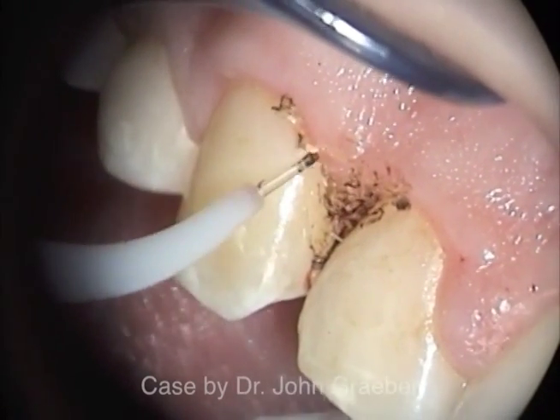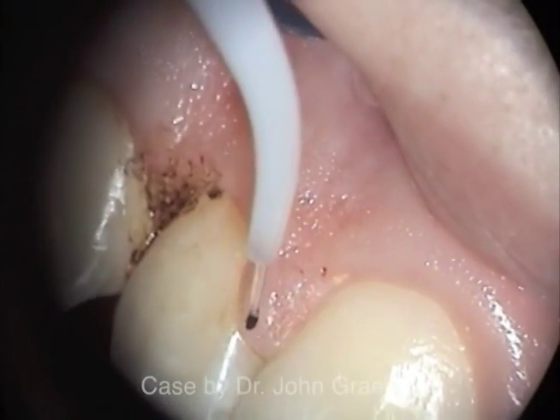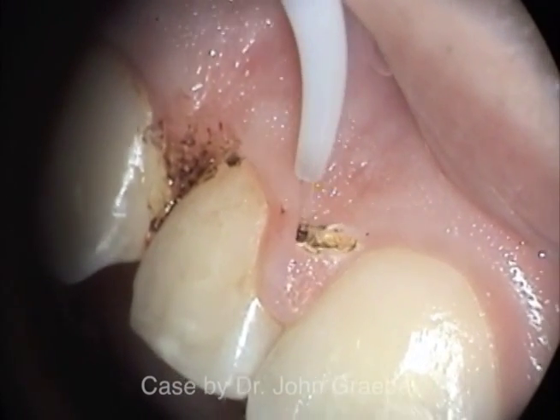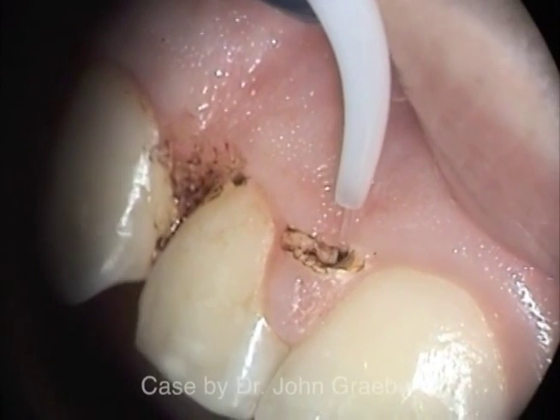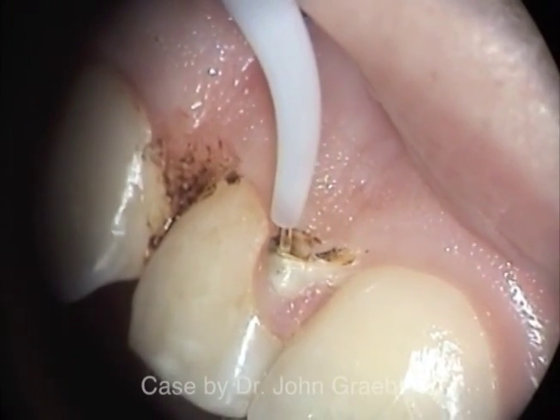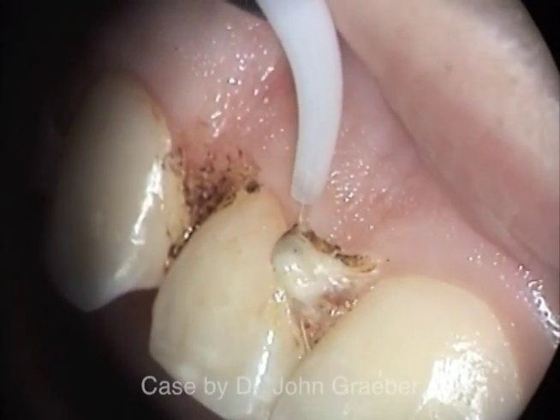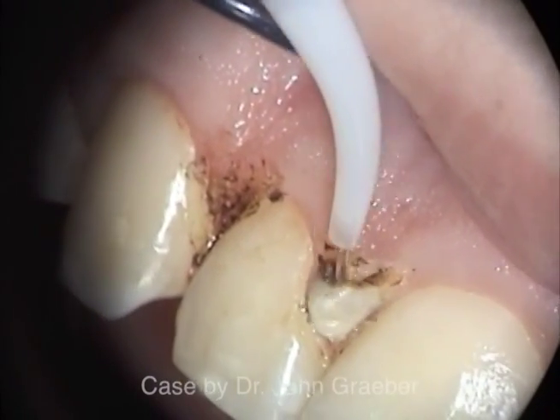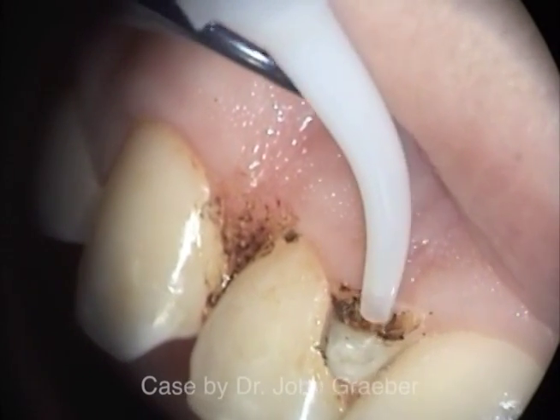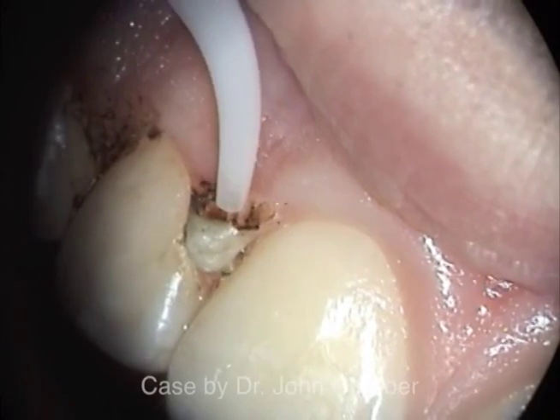In the second surgical site, a larger amount of tissue will need to be removed. It is interesting to note how the diode laser coagulates simultaneously with cutting. If an insufficient bulk of tissue has not been removed with the initial incision, the additional tissue can be removed during the beveling phase. Caution is again urged in not causing deep thermal damage by unnecessary power or time of treatment.